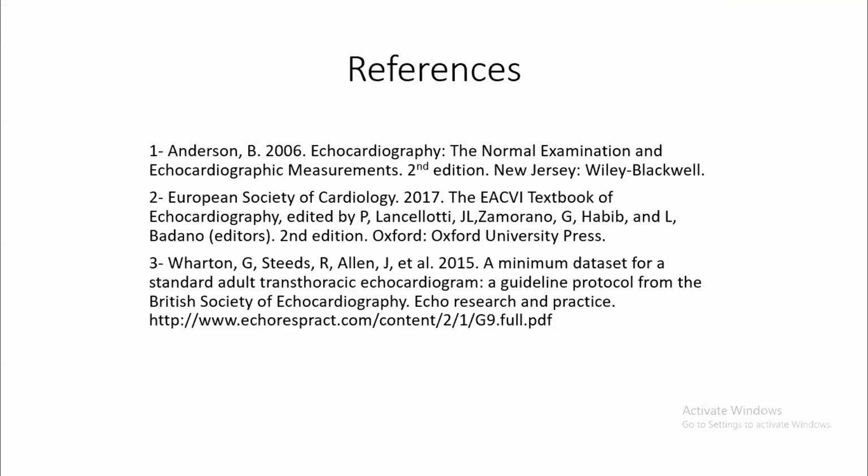Subcostal view. This is a classic subcostal view. 32% say parasternal long axis. No, of course, this is not the left parasternal long axis. In the left parasternal long axis, you will see the right ventricle outflow tract, the left ventricle, aorta, left atria. This is the subcostal view, and you can see up here the liver, right ventricle, left ventricle. This is a subcostal view.